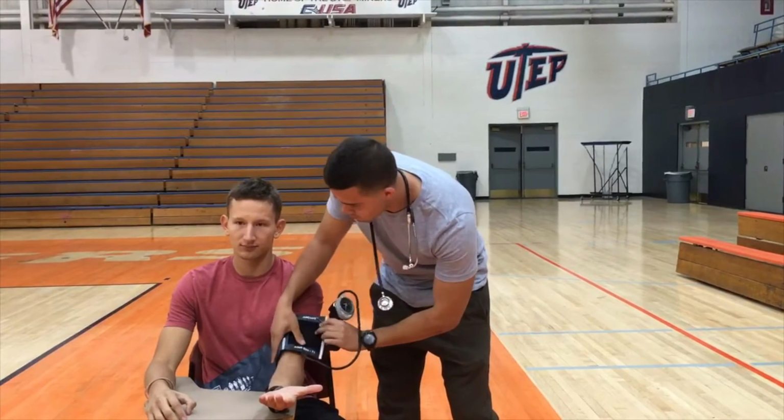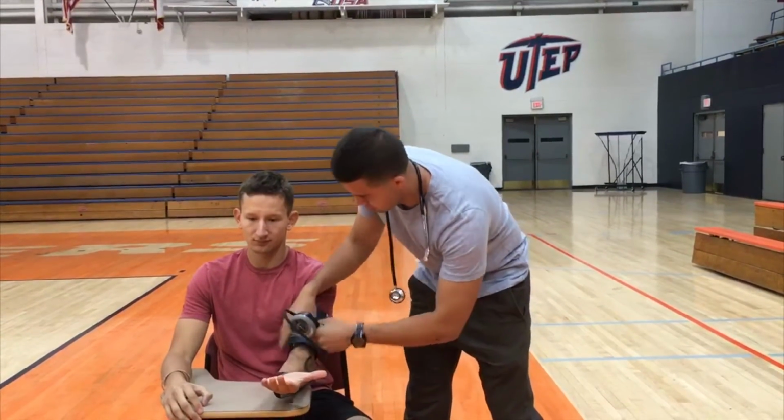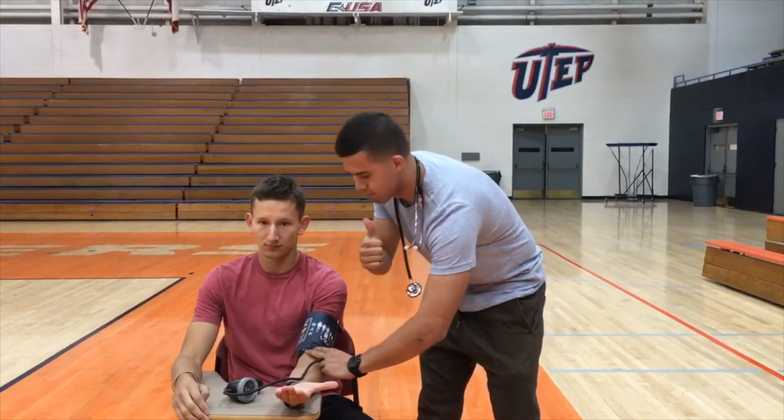Next, we will line up the artery arrow that is on the cuff with the client's brachial artery, placing it 1 inch above the client's antecubital space. We take 2 fingers and make sure they fit snugly under the cuff to ensure that the cuff is neither too loose nor too tight on the client's arm.